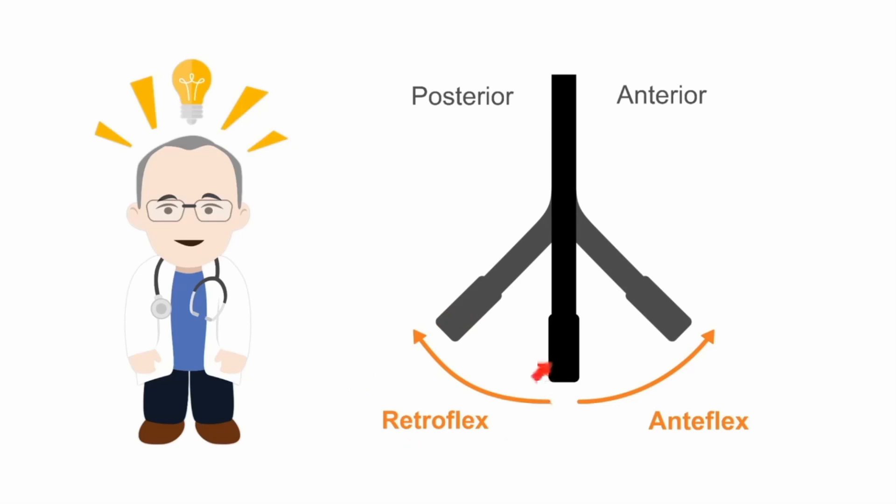The problem with retroflexing the tip of the probe is that we start to lose contact with the anterior wall of the esophagus, so image quality can start to deteriorate. Sometimes we have to accept a compromise between the amount of retroflexion we apply to optimise the image, without deteriorating the overall quality by losing probe contact.